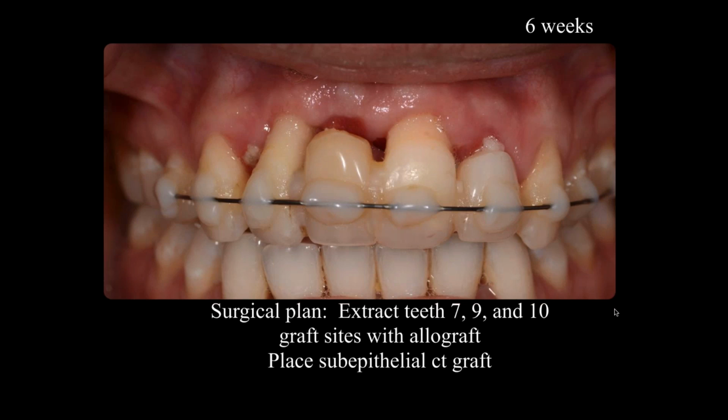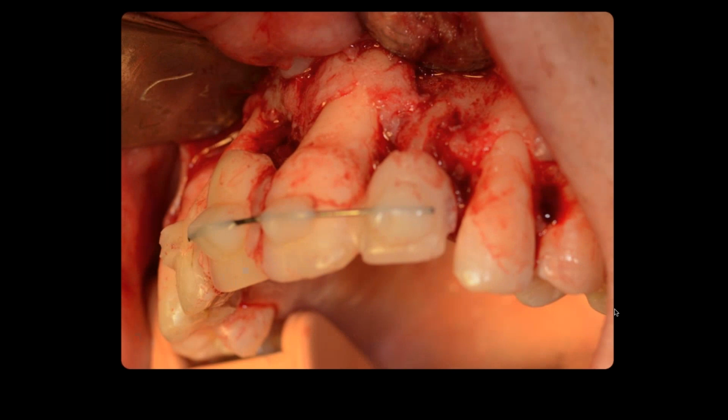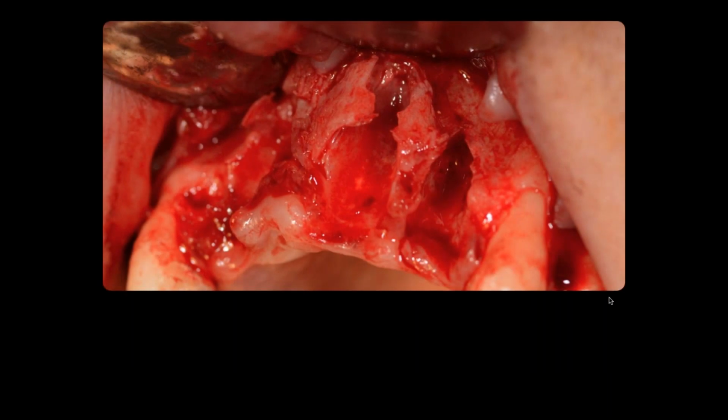So 6 weeks after the injury, her tissues have revascularized. Obviously, there's some recession. I told her we have to do a lot of work. Then we have to know where to put the implants, but we have to graft you first. So we grafted her, and so I make an incision, raise the tissue up, and you can see the tooth and tooth roots, and it's pretty much a mess. Poor girl. And we took out the teeth, and now you can see the defects in the bone.